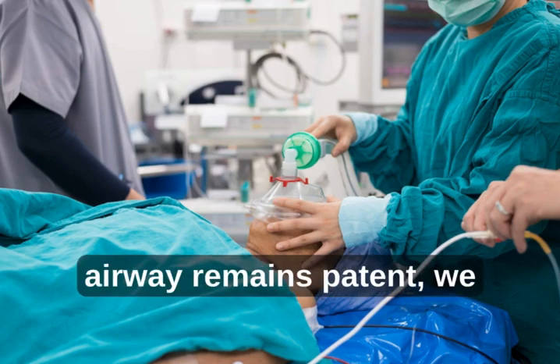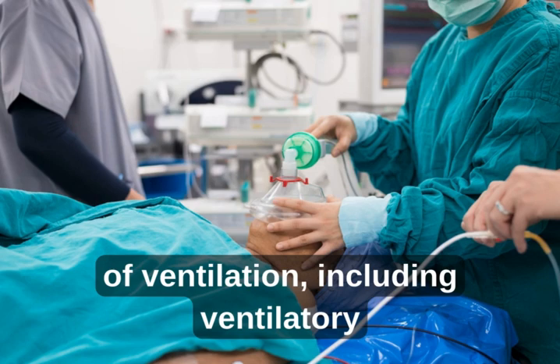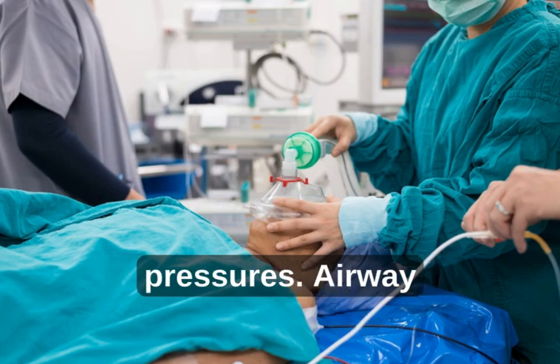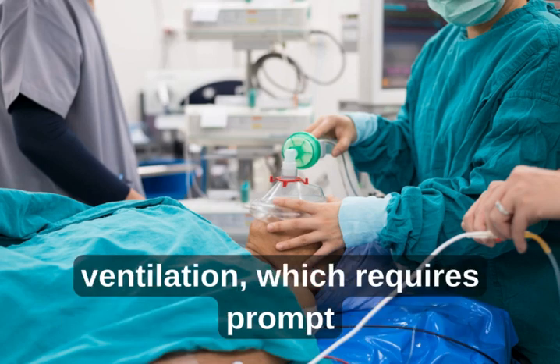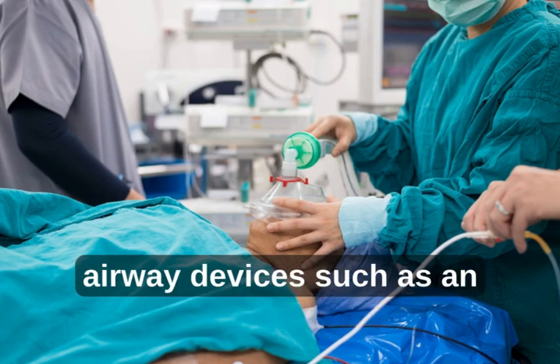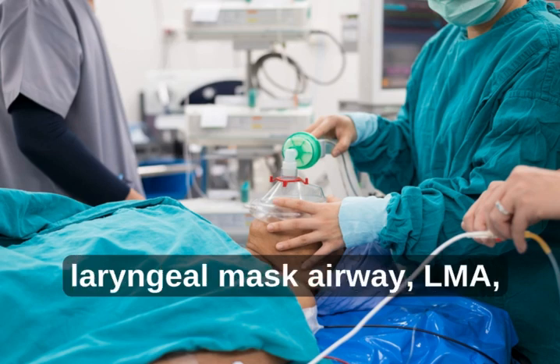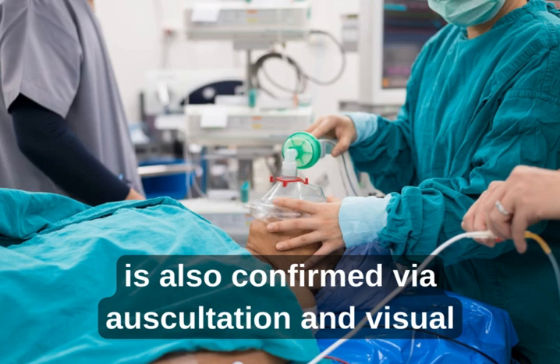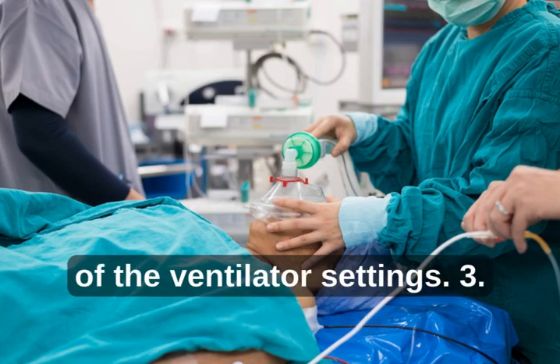To ensure the patient's airway remains patent, we also monitor the mechanical aspects of ventilation, including ventilatory pressures. High airway pressures can indicate obstruction or difficulty with ventilation, which requires prompt intervention. The proper placement of airway devices such as an endotracheal tube, ETT, or laryngeal mask airway, LMA, is also confirmed via auscultation and visual inspection, along with monitoring of the ventilator settings.